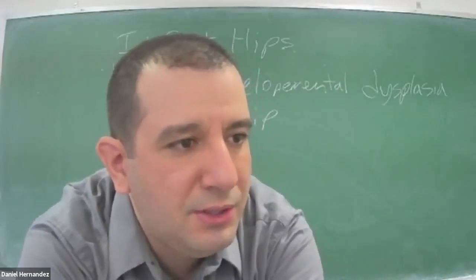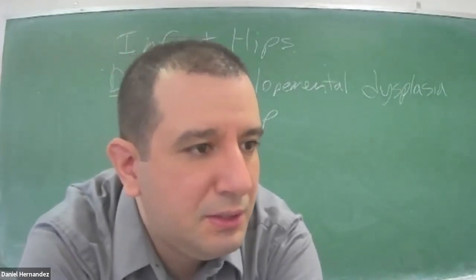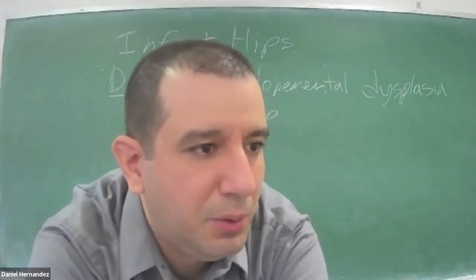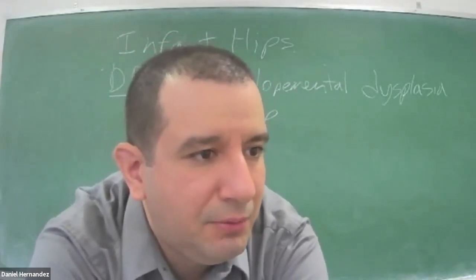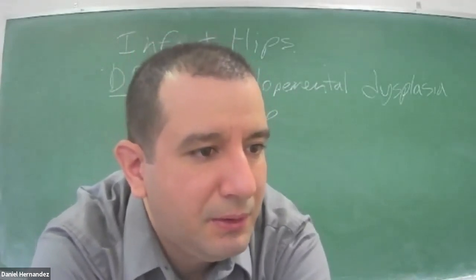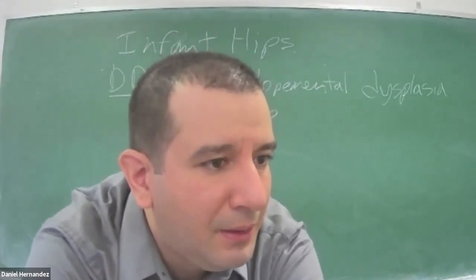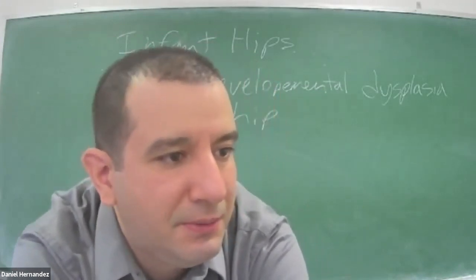So if there is a question of hip dysplasia, it's important for these ultrasounds to get done in order to correct the situation and prevent permanent damage from those muscles and ligaments tightening and causing permanent dysplasia of the hip. This fibrofatty pulvinar may also develop in subluxation.